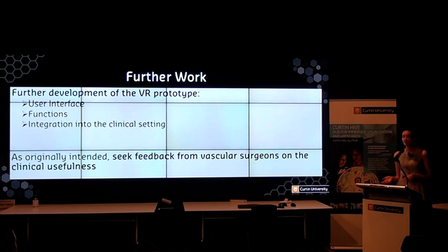For something to be used in the clinical setting, it needs to be pretty much press a button and then this happens and then they can use it. Obviously at this point, an 80-minute process isn't something that surgeons are going to sit down and have the time to do. So being able to make this more intuitive and more seamless in the clinical environment would be a big goal.